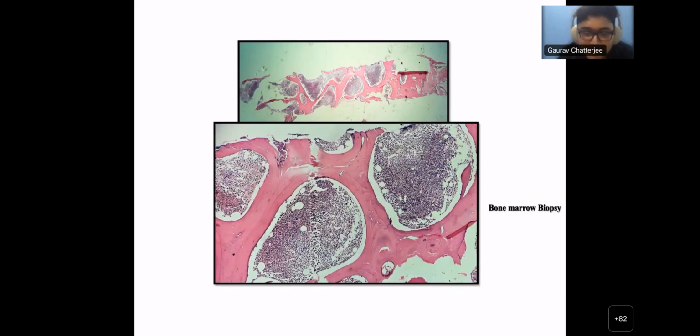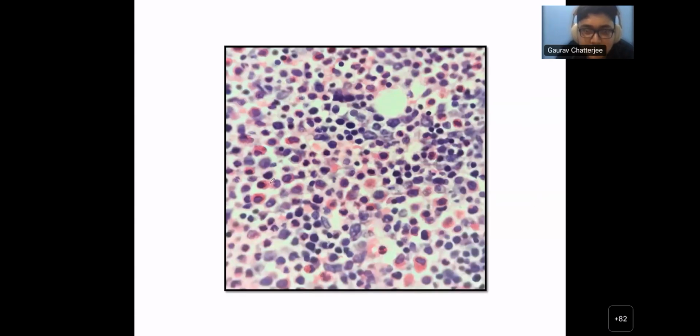I think we're slightly running out of time, but again, we can see a hypercellular bone marrow in this biopsy, right? Some scattered megakaryocytes we can see. This is the picture. Again, you can see some eosinophils present. Some erythroids are there as well. It's not very myeloid preponderant in this. It's a hypercellular bone marrow, but I can't see too much blast cluster.